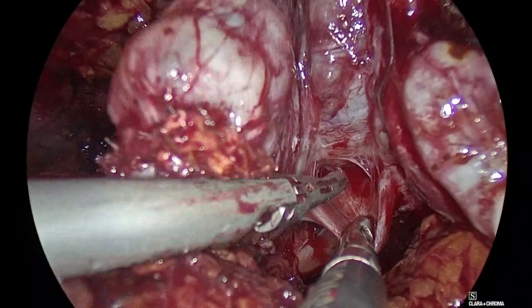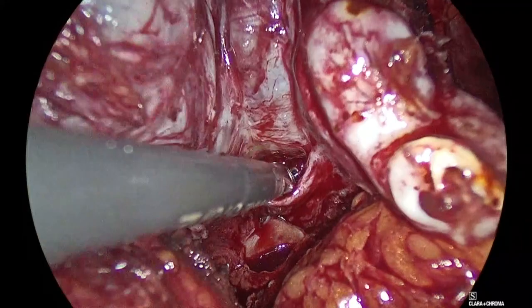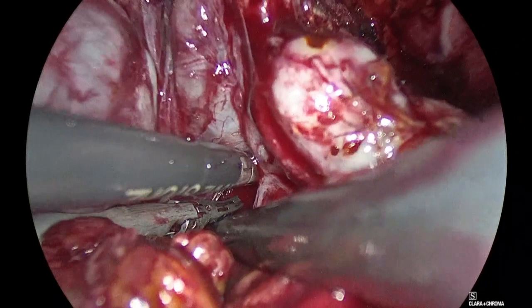Right side, Padeli. Right side. You're fighting with me. Panagiotis, go in here. Good. Pull the prostate out of the pelvis, Panagiotis. And now, right and left. Right and left. Good.